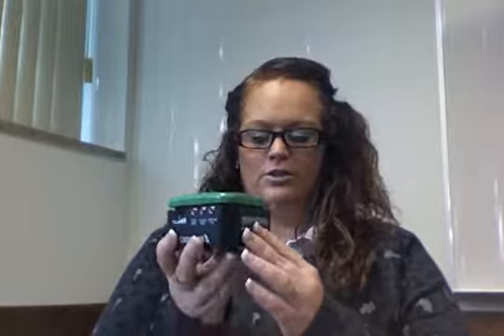Hi everyone, today I'm going to teach you about a communication device. This device here, as you can see, is called a sequencer. What this sequencer can do is record different phrases or sayings or rhymes or anything you want to be able to say. You can record it on this box.